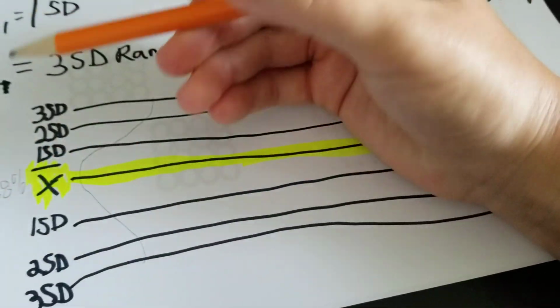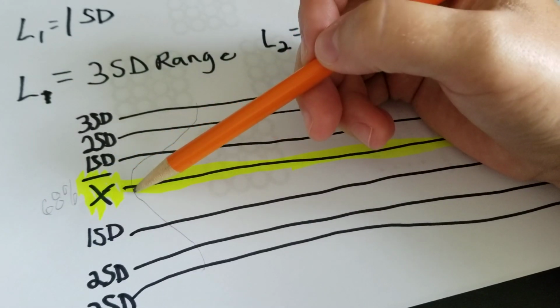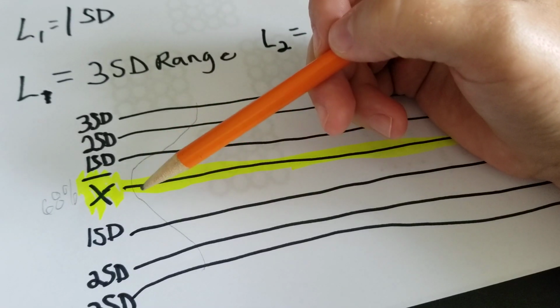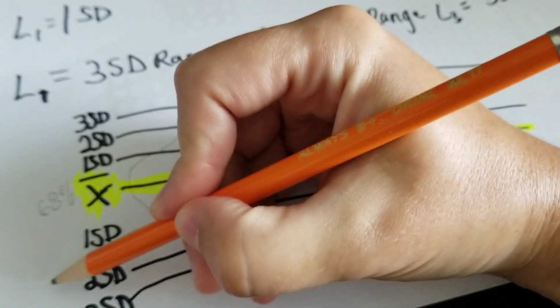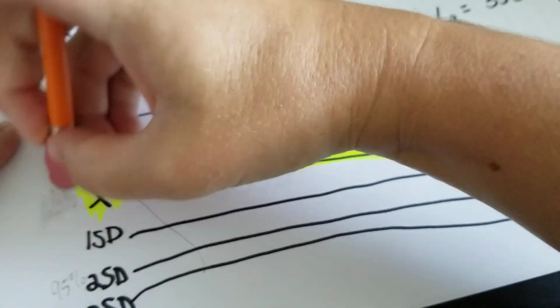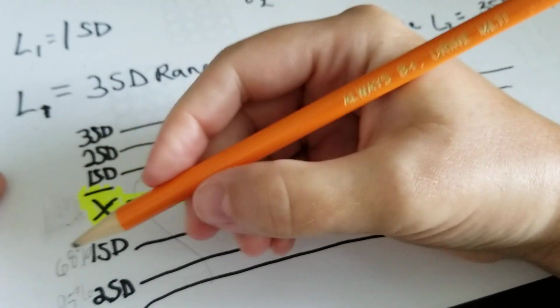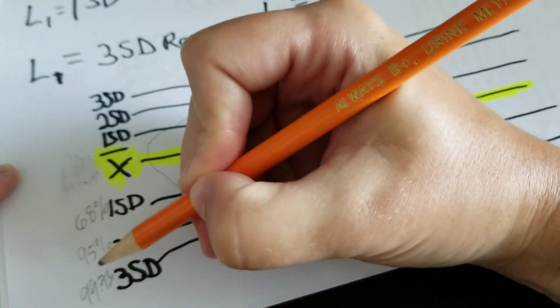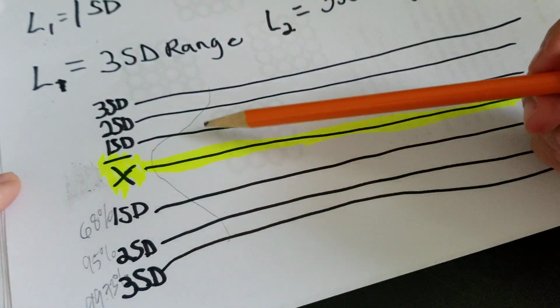68%, statistically 68% of QC is going to fall within this 1 SD range here, and 95% is going to fall within the 2 SD range here, and then 99.73% of your QC is going to fall within the 3 SD range.